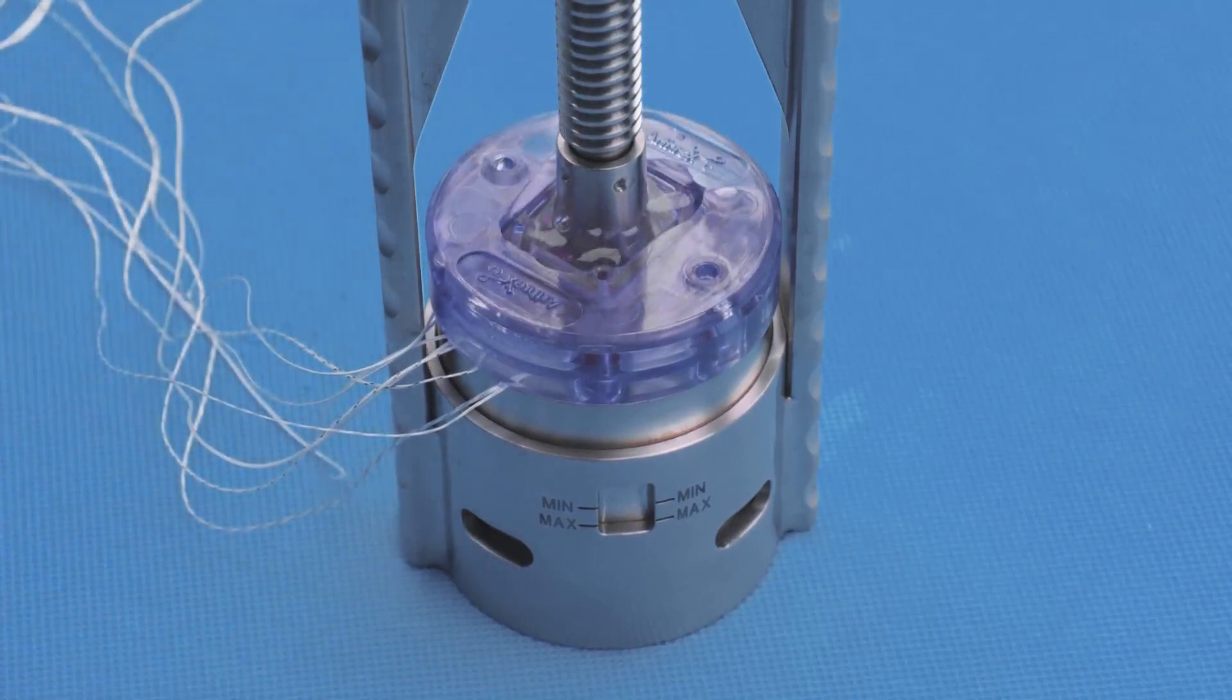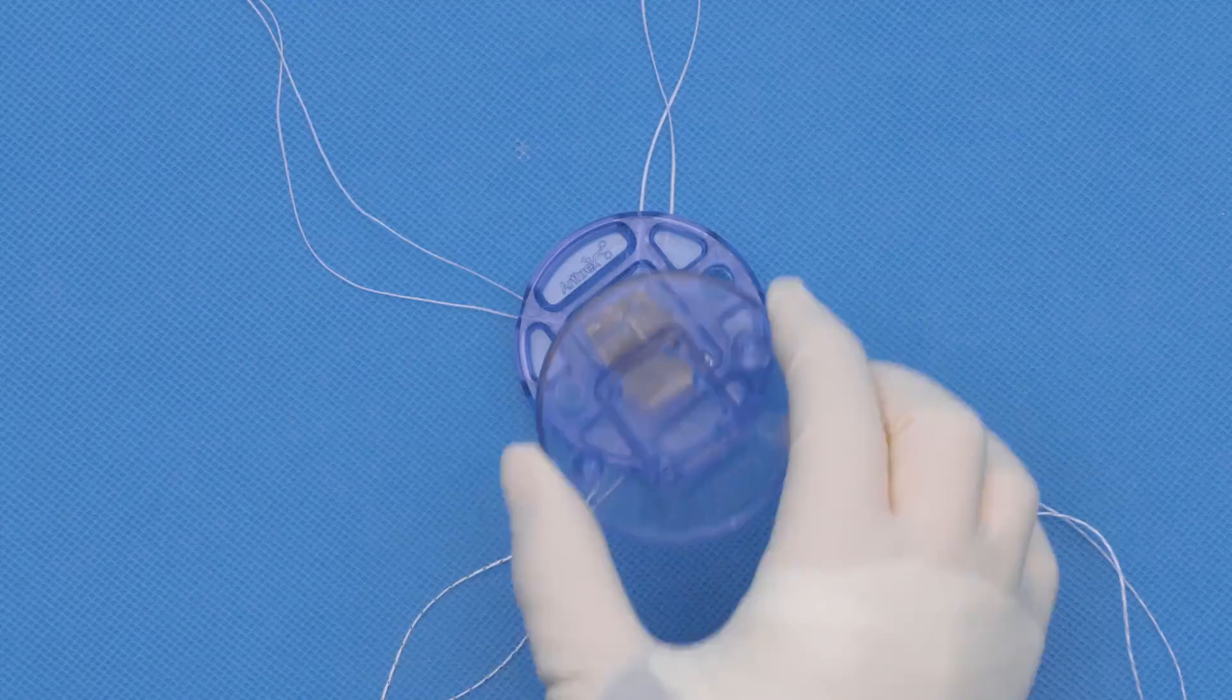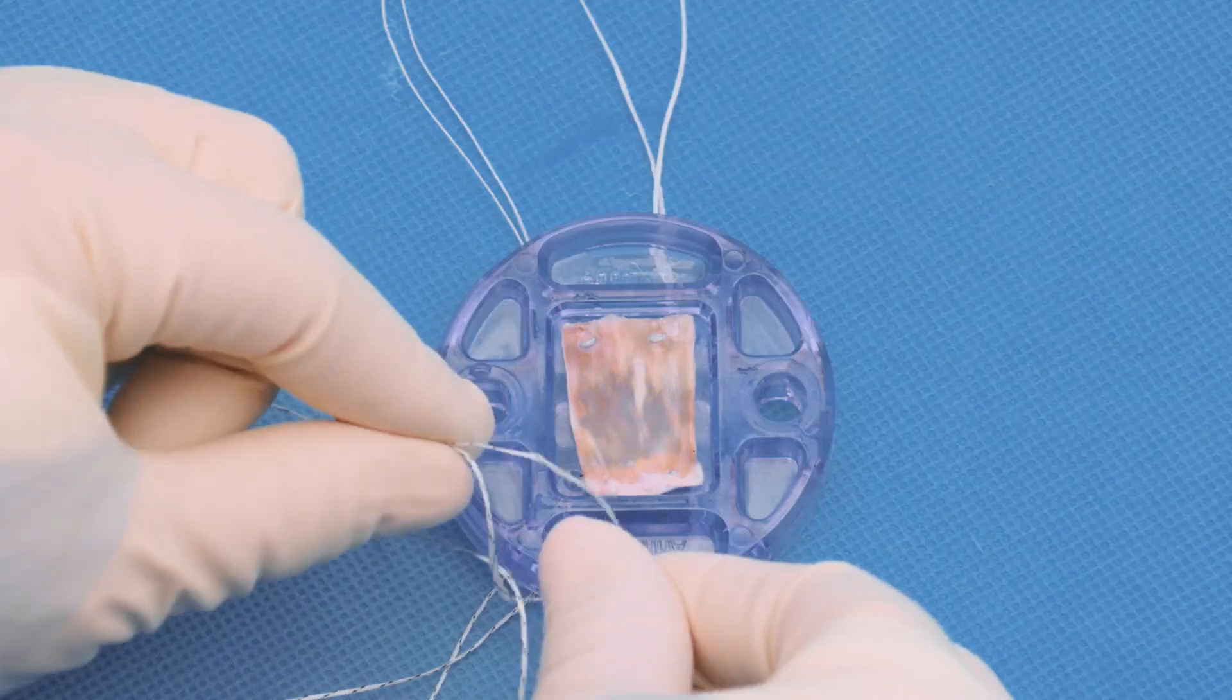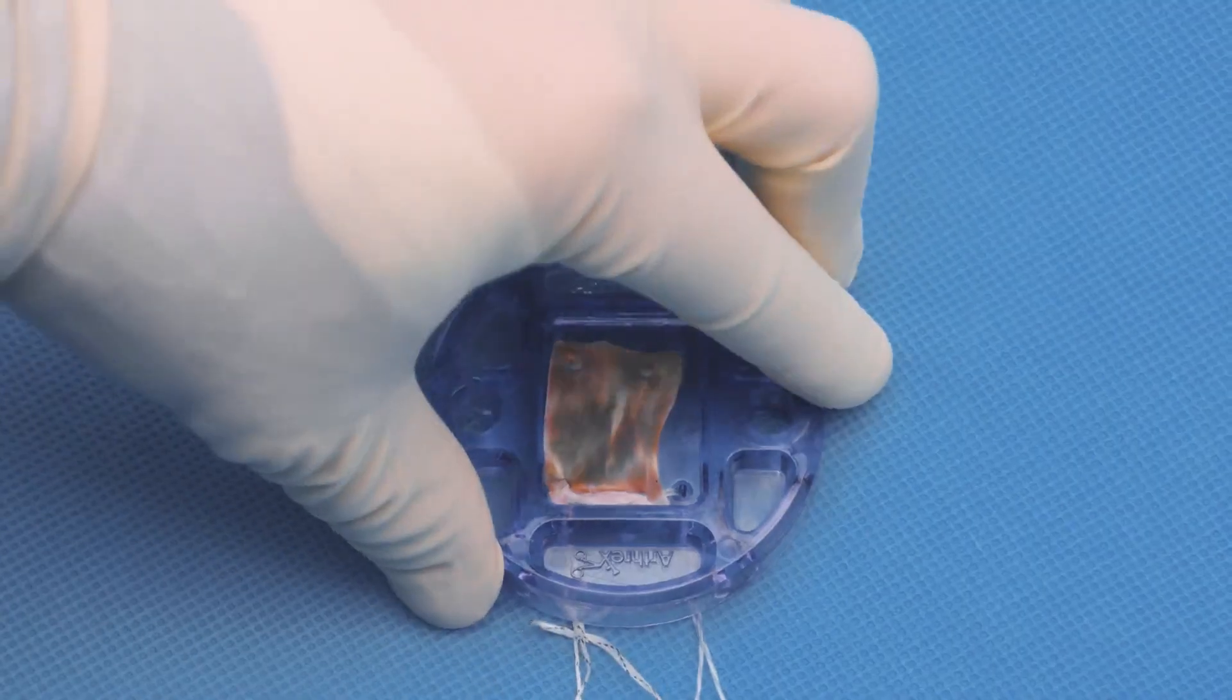When the graft is ready to be loaded into the graft spreader, remove the top plate. The fiber link suture tapes can be cinched into the plates.